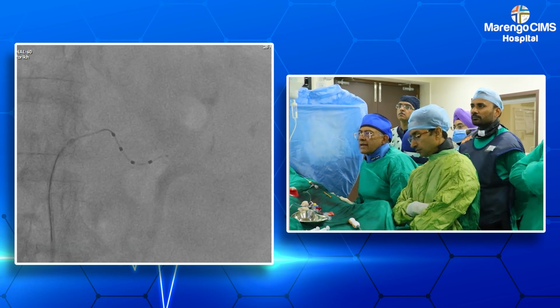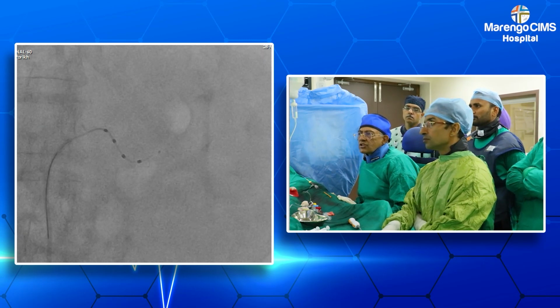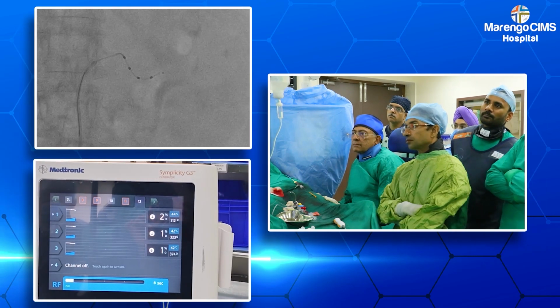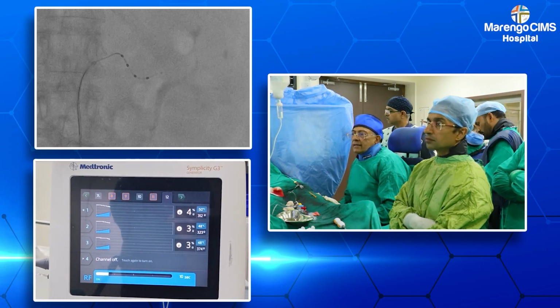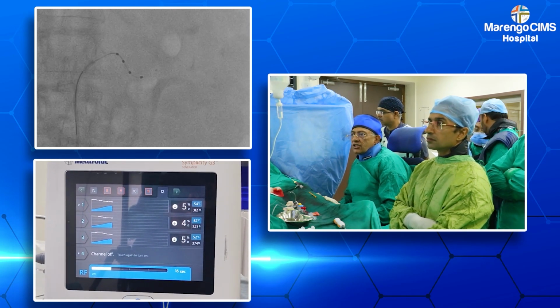Impedance looks good, contact looks good. We'll switch off the 4th electrode, which is the proximal one. Dr. Vipul, why don't you start the ablation with switching off the 4th electrode? Go ahead and start. Again, we are now ablating inside the proximal of the 3 inferior branches.